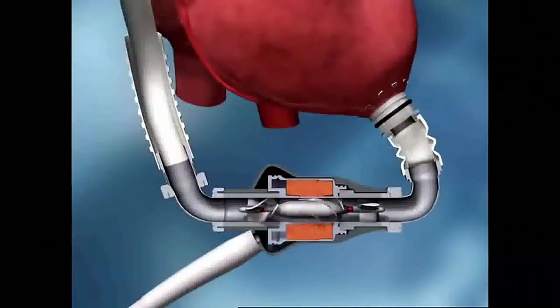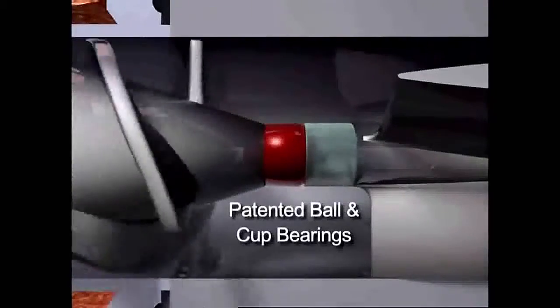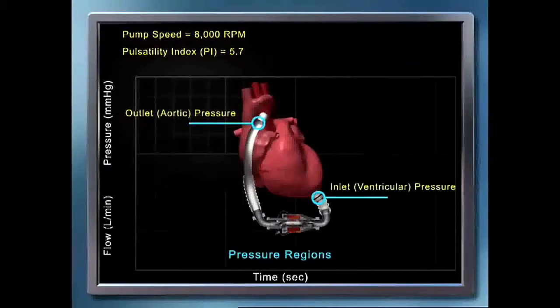The HeartMate II's patented ball and cup bearings are designed for long-term reliability and the minimization of blood damage. Pump flow is defined by two factors: pump speed and the pressure difference across the pump. For a fixed pressure difference across the pump, increasing the pump speed will increase pump flow. At a fixed pump speed, decreasing the pressure difference across the pump will increase pump flow.